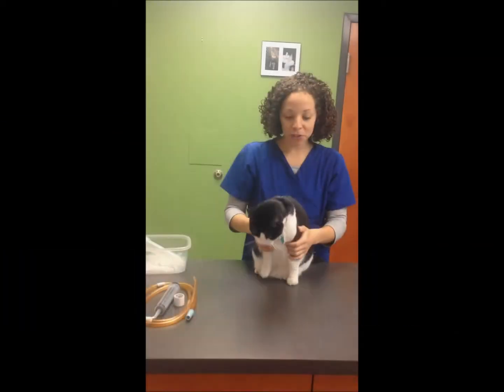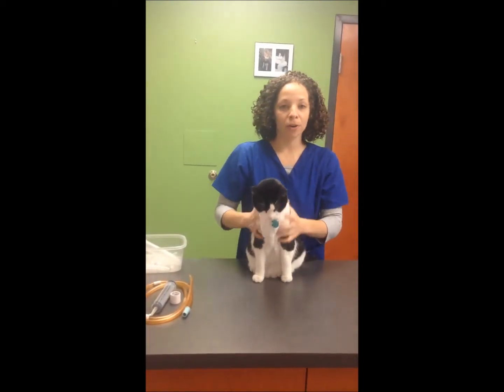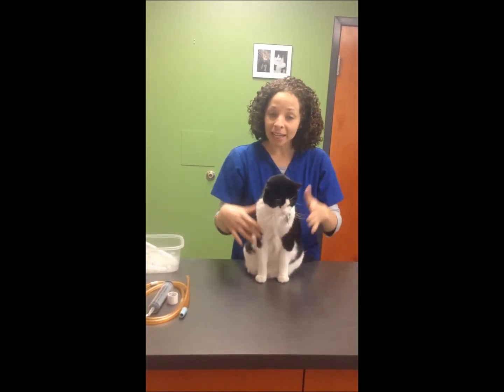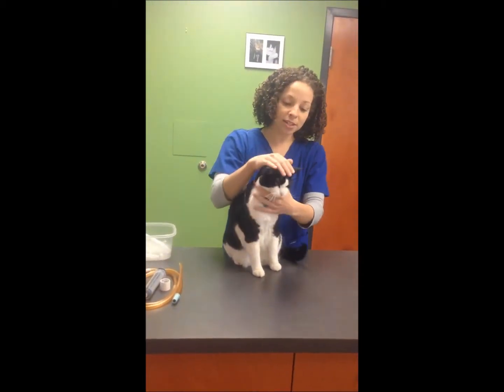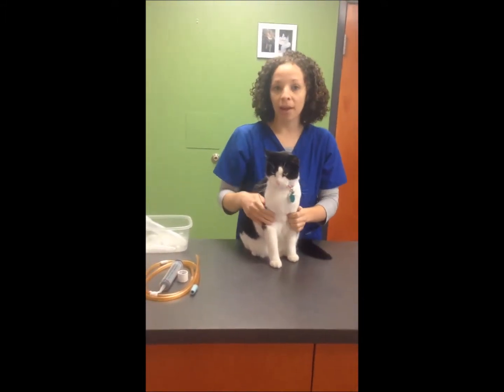So today we're going to discuss the basic procedure for doing an upper gastrointestinal contrast study. And this is Mona. She's one of our clinic kitties here at Midlothian Animal Clinic, so she's going to be our patient for today.